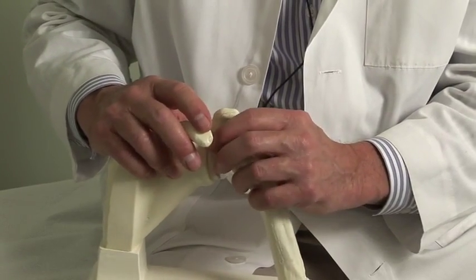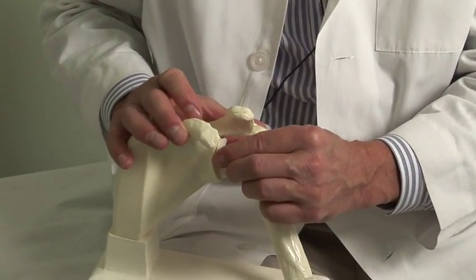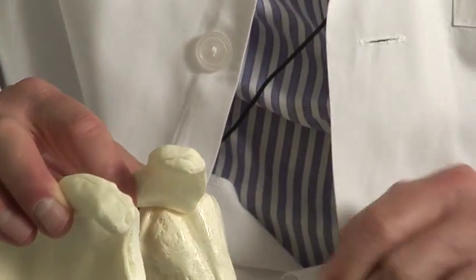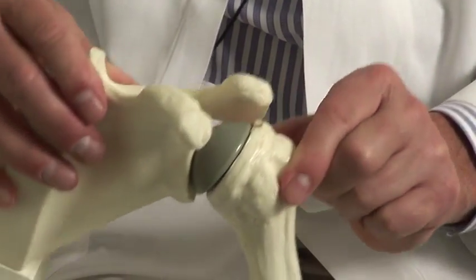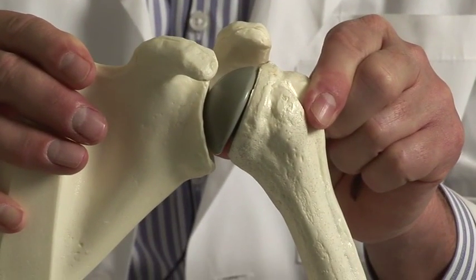If there's insufficient bone on your socket side where we can't insert the plastic, we will be replacing the ball. We will be reshaping what's left of your socket, and the ball will now articulate directly against your native socket without a piece of plastic interposed.